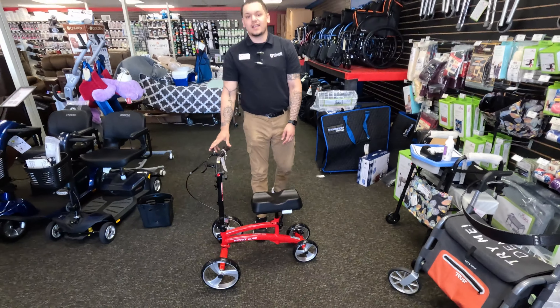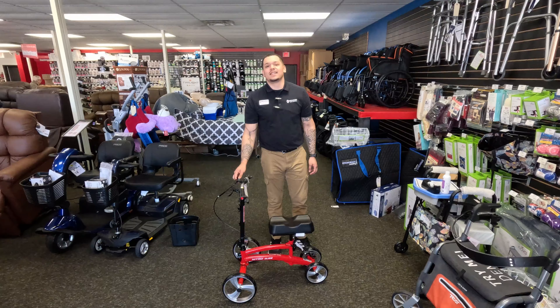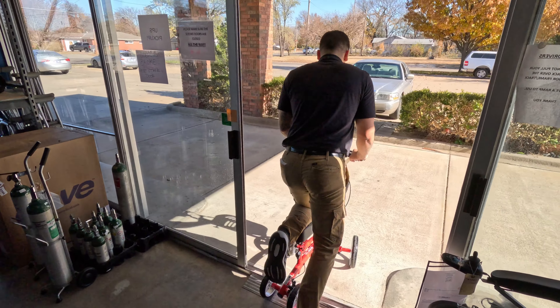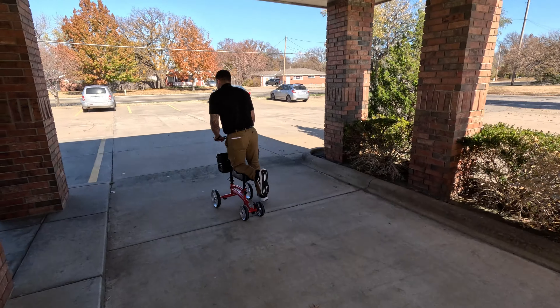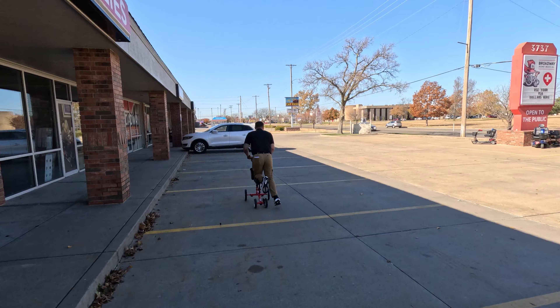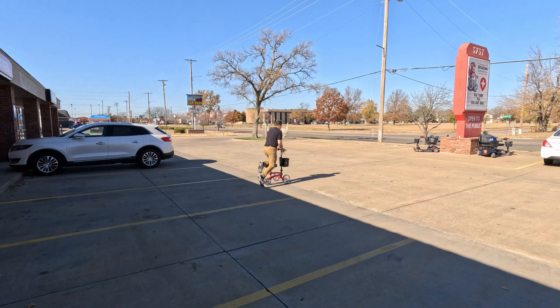Now that has been the Nitro Glide — let's go ahead and take it for a spin. Here we have a slight decline; couldn't really notice that, definitely felt stable still. We're going to go over some of these little cracks and bumps. With the tires, it definitely feels like you can get over these pretty easily.